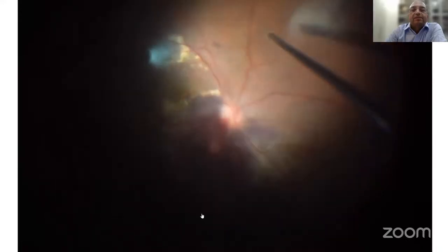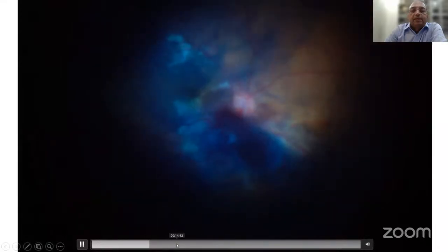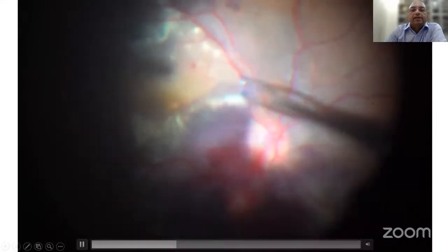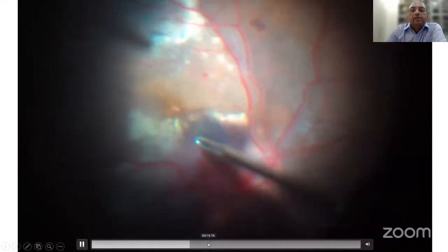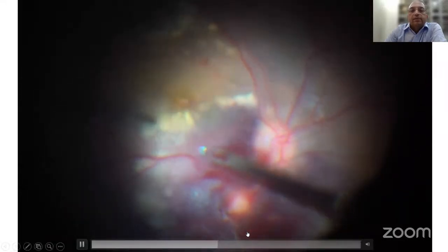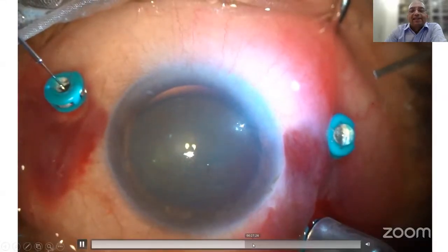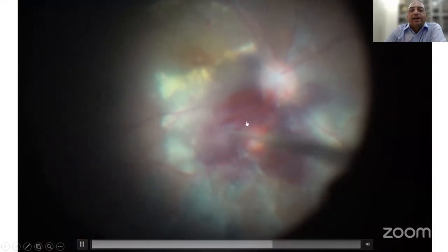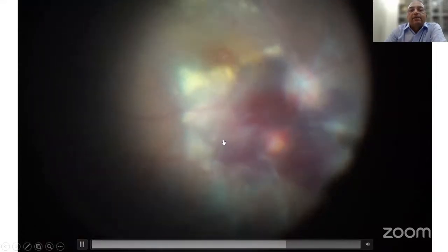This is the patient where I also used automated injection of subretinal TPA. As a rule, we try to peel ILM first before subretinal injection, because things are quite controlled and clear. So I made sure I am removing all the ILM, which I'll repent later. Now again, I am trying to inject away from the disc and at the place where you have maximum height.